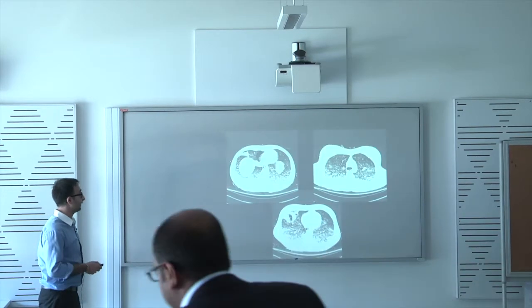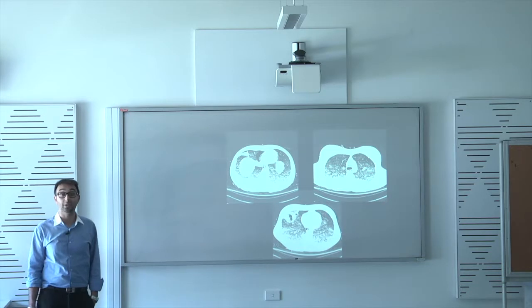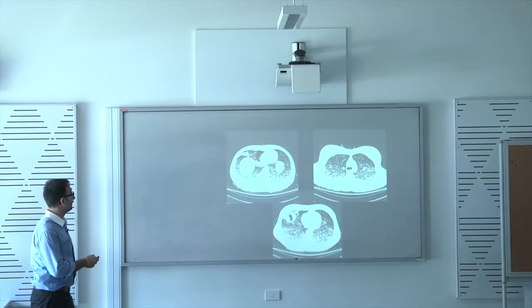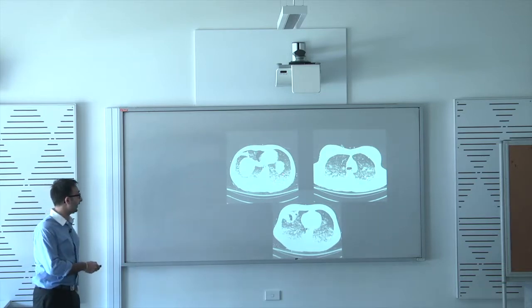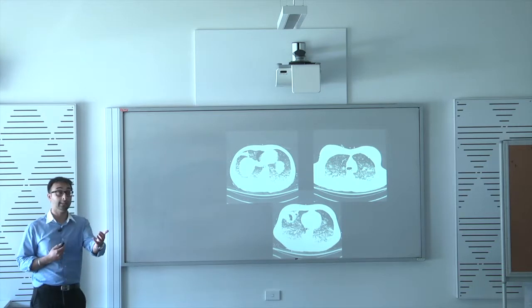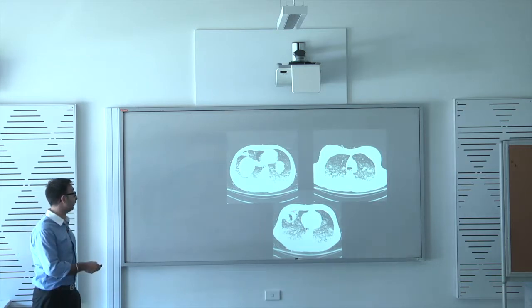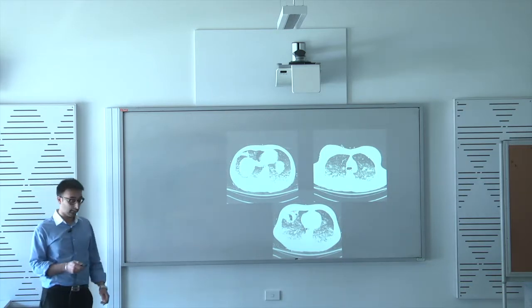I'll just show you the CT, to make sure that we're not lying. You can see the axial slices, lung windows. It shows they do indeed have a pneumothorax here. They've also got lots of pulmonary contusion, you can see with consolidation. There's also an area of cystic airspace in here, and often when the lung lacerates, it recoils, and then you get little areas of cystic change or blebs. That would be consistent with a pulmonary laceration.